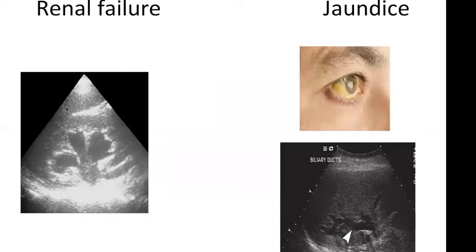And of course, in the failures, ultrasound is extremely useful because what it will do is demonstrate the anatomy and will differentiate, particularly in renal failure, between renal causes and post-renal causes. So pre-renal causes and renal causes are medical, as we all know, and post-renal causes are surgical. So it will select out patients using ultrasound which are obstructed and hydronephrotic. And if you've got bilateral hydronephrosis and you've got renal failure, then you've got to assume it's due to obstruction, and the pathology is either in the retroperitoneum or at the bladder level. And these patients can do well with nephrostomy or intervention.